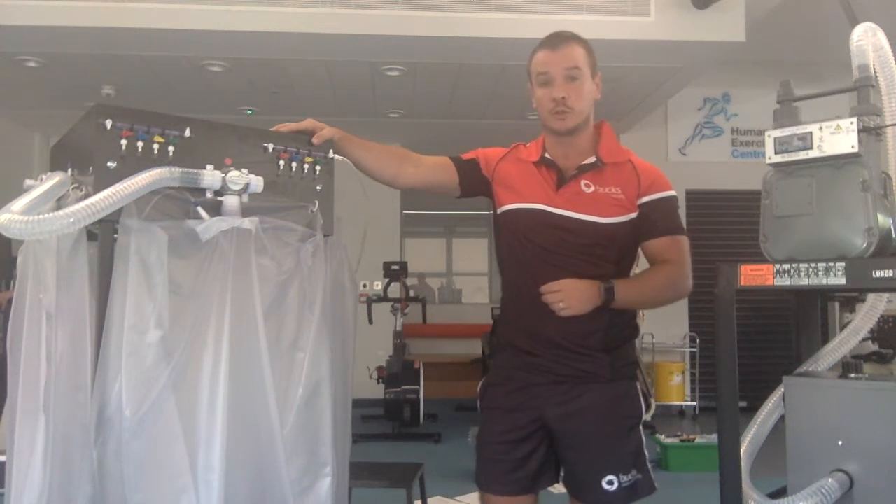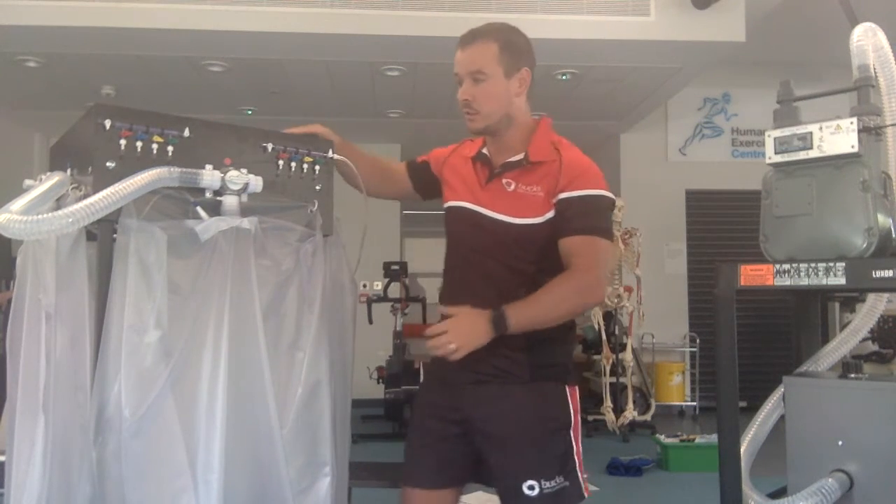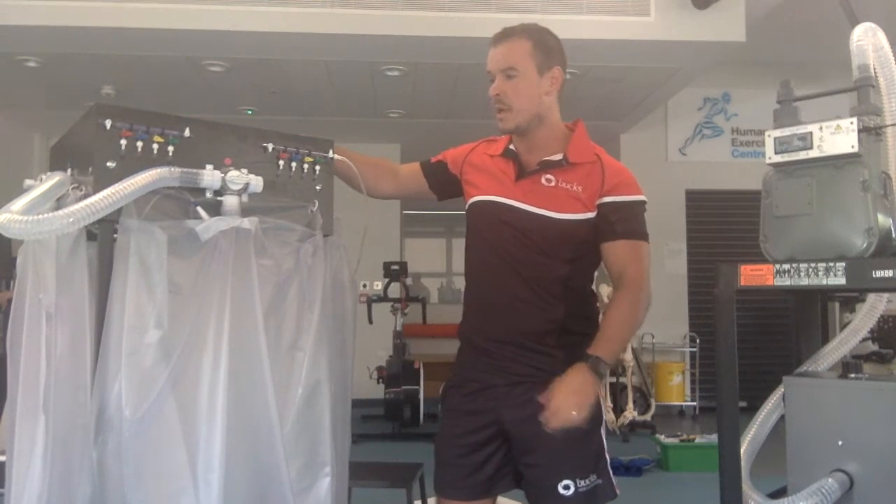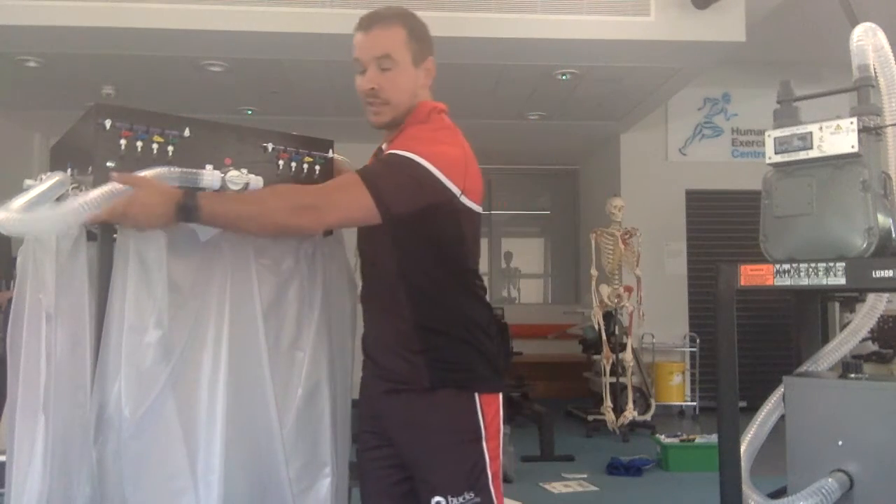Each of these racks have four Douglas bags. They're colour coordinated — red at the front, blue, yellow and green — and they're all connected together by this plastic tubing.